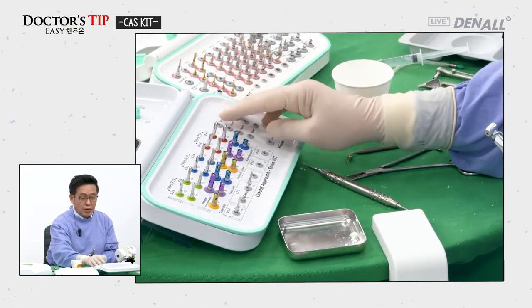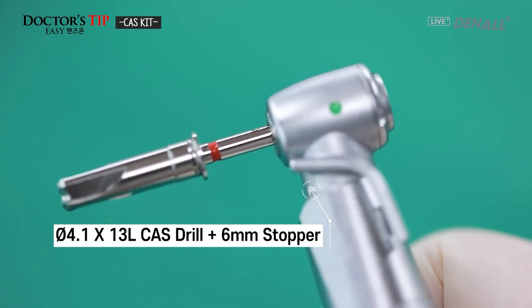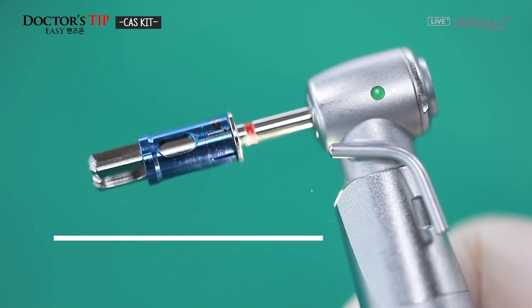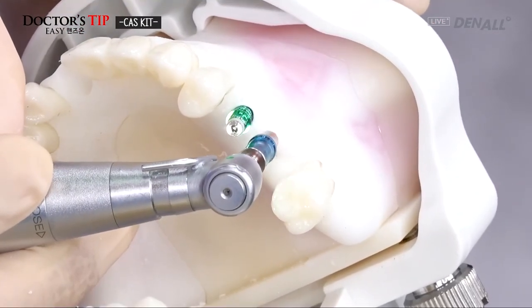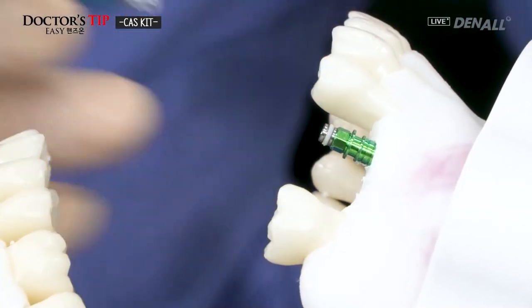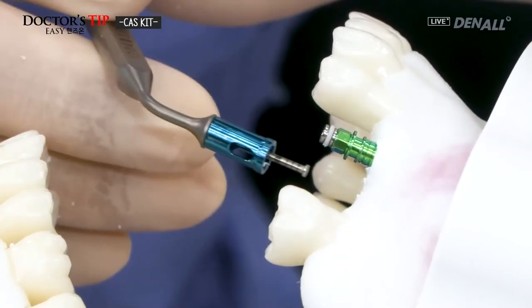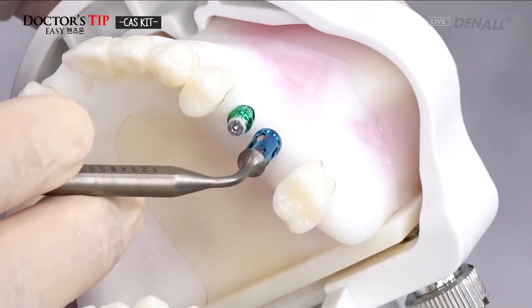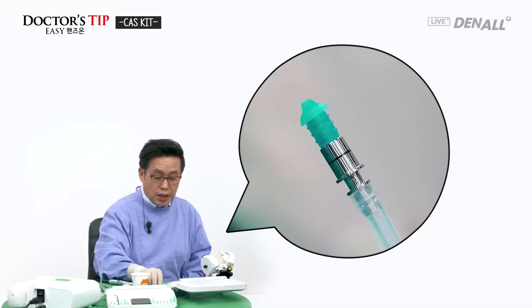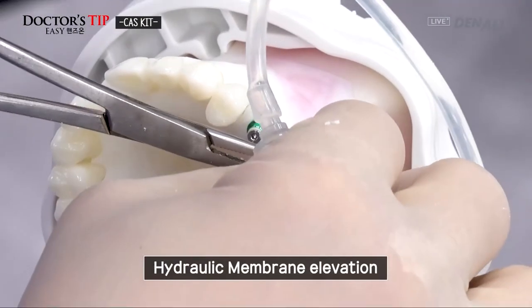A 5.0 fixture is to be installed. So the 4.1 CAS drill is to be used with the 6 millimeter stopper for the drilling. Now I can feel it is penetrated. Now it is connected to the depth gauge. The sinus floor, part of it is penetrated, so the hydraulic lifter is to be used again, and it is adapted to the hole.